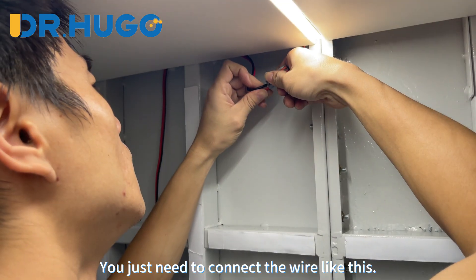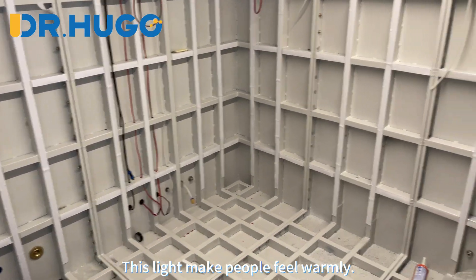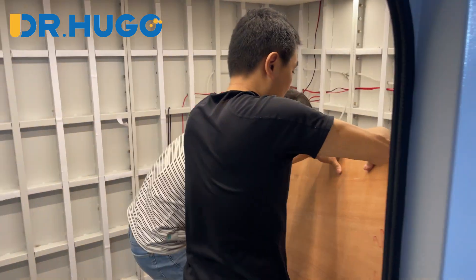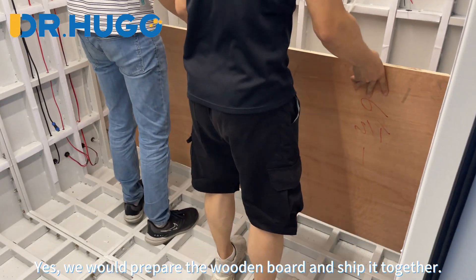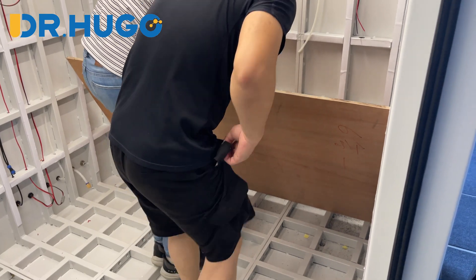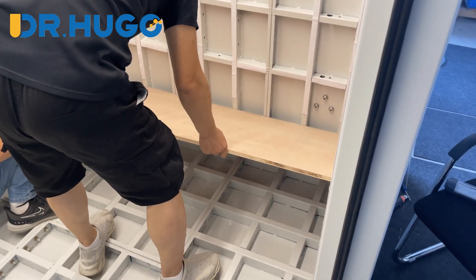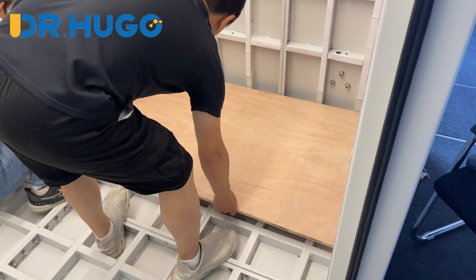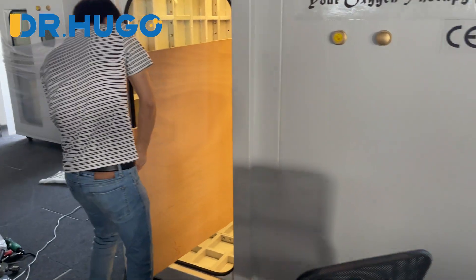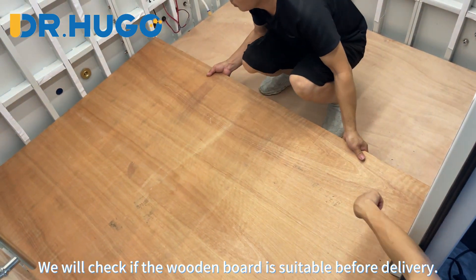You just need to connect the wire like this — it is easy. This light makes people feel warm. Before we install the board on the side, we need to put the bottom wooden board in place. We would prepare the wooden board and ship it together with the unit.